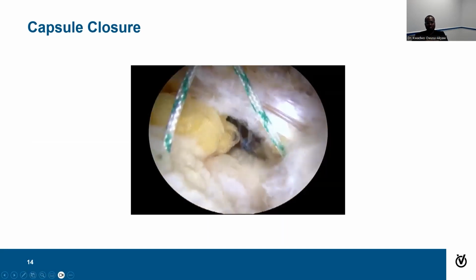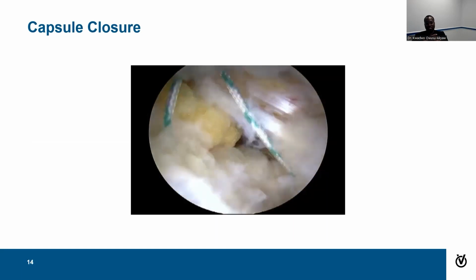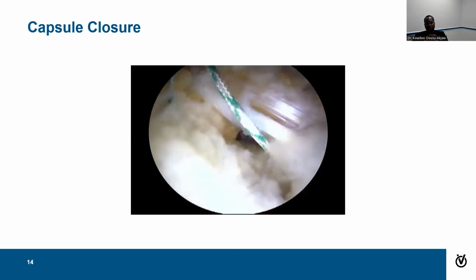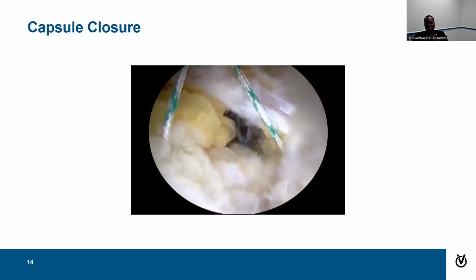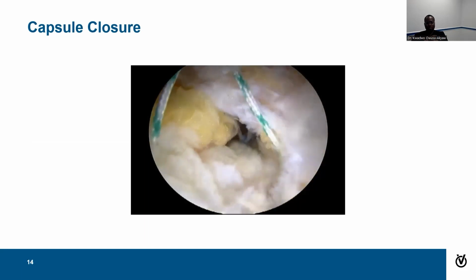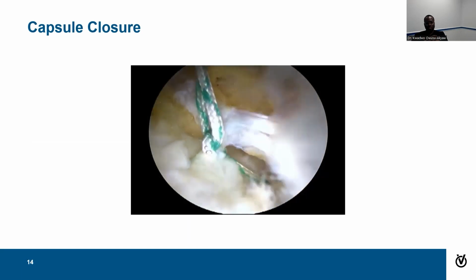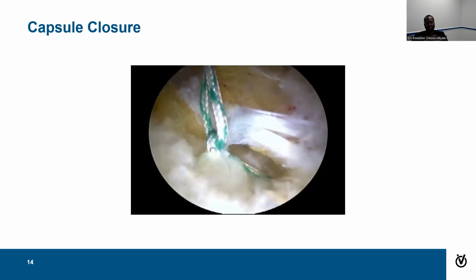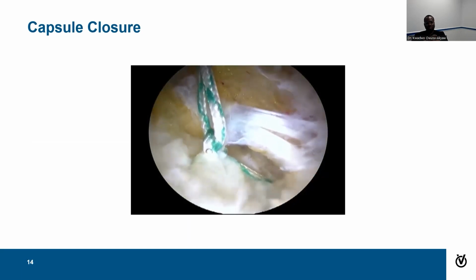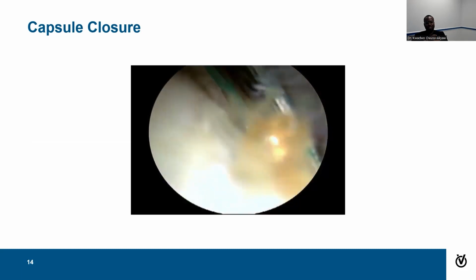So now we have another suture or stitch. This one's green. We passed them on both sides of the capsule cut. And now we use what's called an arthroscopic knot pusher. It lets us tie knots on the outside of the body, and we can use this little pusher you'll see in a second. It's almost like a metal rod to push that knot down into the joint. So here comes my knot. And what you'll see soon is I'm going to push down this metal rod to help push that down into place. There it is. So I'm pushing my knot down.